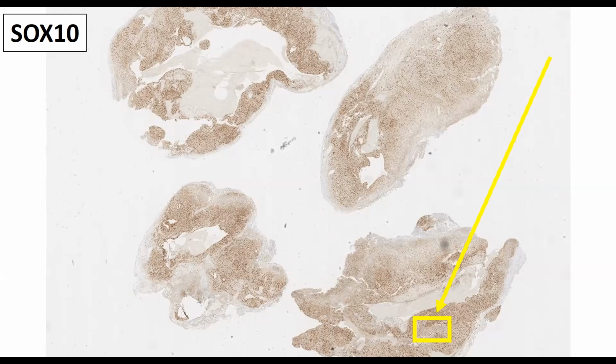That morphology, spinal cord, schwannoma, and you stop looking, because you're lazy. You're not thorough. You would have missed it. You would totally have missed it. You had 3 paraffin blocks to look at. You look at one, look at another, and oh my gosh, well, you know what? Dr. Campbell did not miss this.